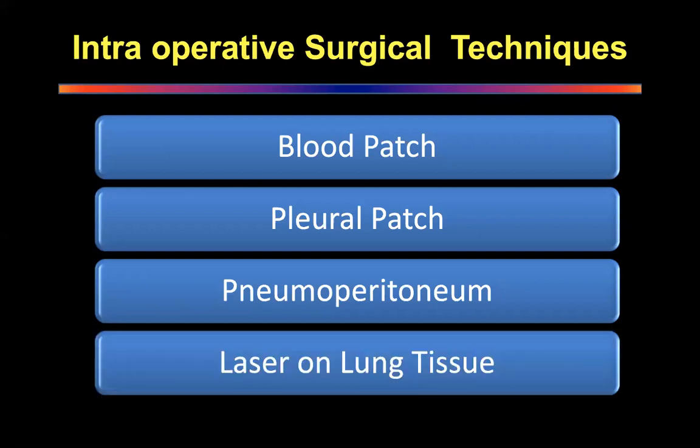So that's another technique. Some people have access to lasers, and lasers are really good for use on the lung because they are pneumostatic. It is a good idea to consider lasers when you are doing a metastasectomy, particularly when you're trying to excise out multiple metastases. Some of them, you may not be able to staple, particularly when it's a deeply situated metastasis.